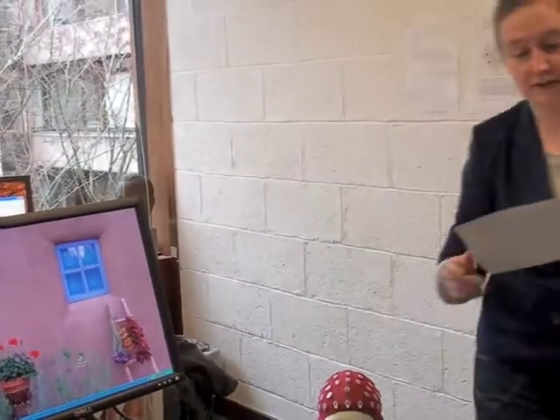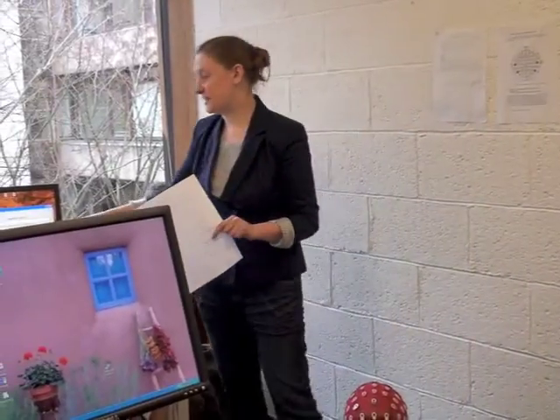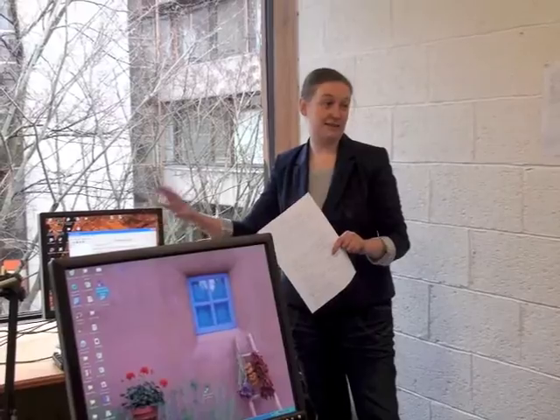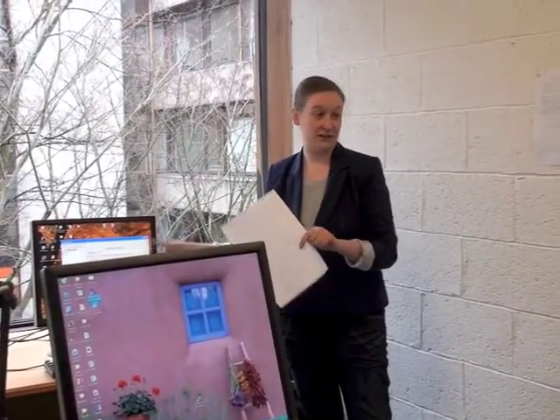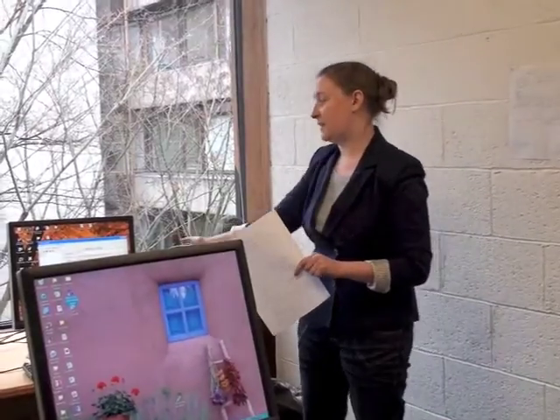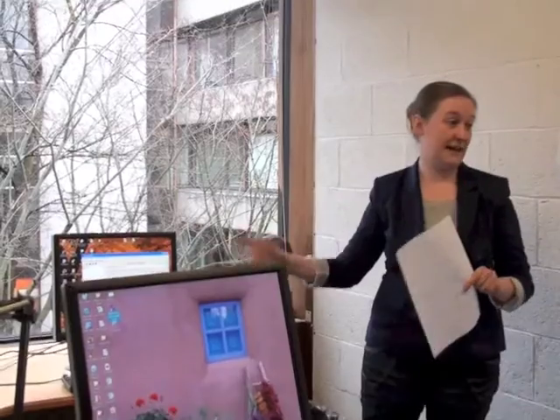Put the sign on the door, set up the equipment. Presentation is the program I run my stimuli on, and it's very good because of its timing, because timing is what I'm interested in. Presentation is good at being accurate in terms of time. So I can set up my presentation experiment tailored to participants.